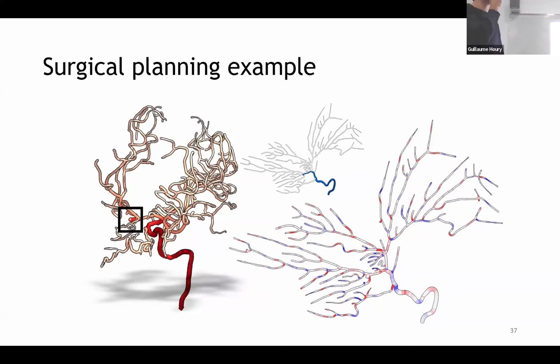Basically, the 2D coordinates here are just features of each vertex. So if we have a way to track things on the 3D tree, then we can just transcribe it on the 2D projection very easily. Similarly, everything that we can represent here can be represented here directly without any overhead.